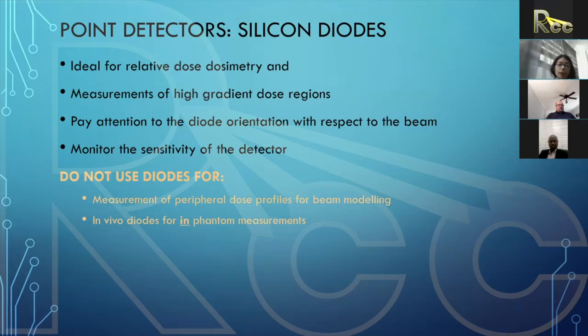They are not recommended to use, for example, do not use in vivo diodes to place inside a phantom for measurements, and also for measurements of peripheral dose profiles for beam modeling.